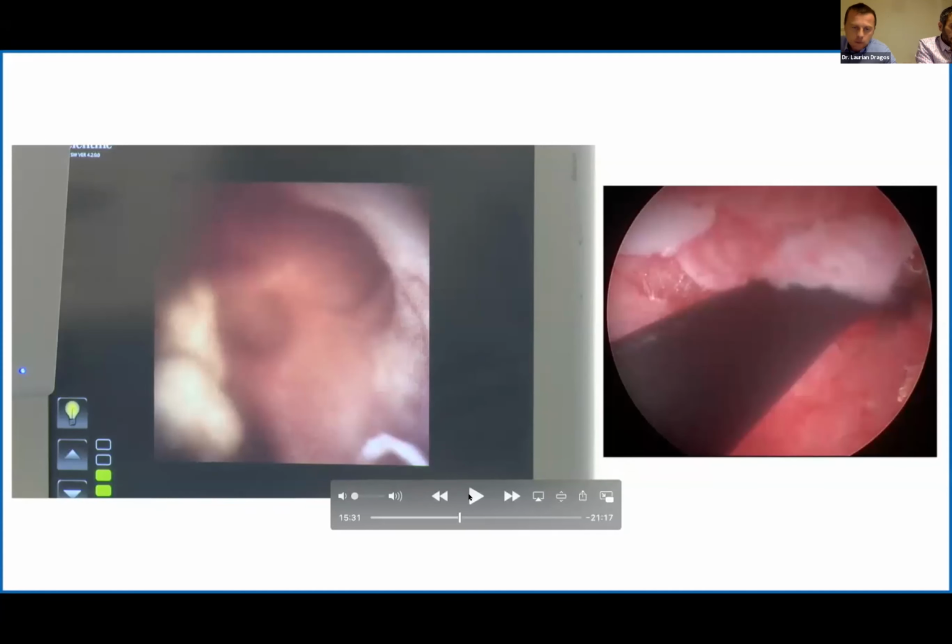And I had to use the laser. Everything went well, but I would have loved to use the probe and to solve them. Yeah, that would be the 450mm probe then, rather than the shorter one. You probably have to use the 625mm one for that, actually. Exactly. Which we don't have in our books, but you have to have the 625. The 45cm probe is not long enough.